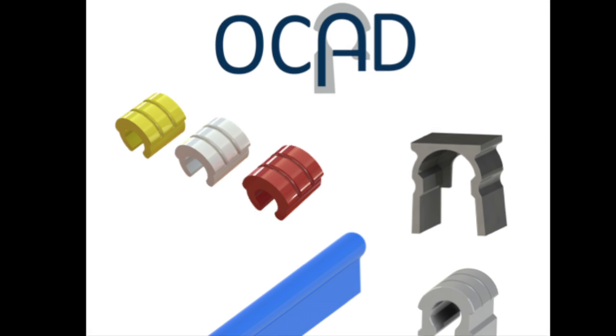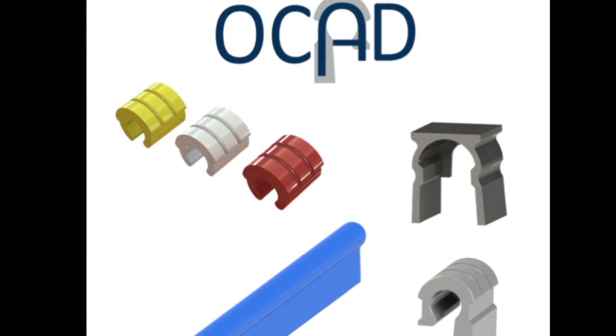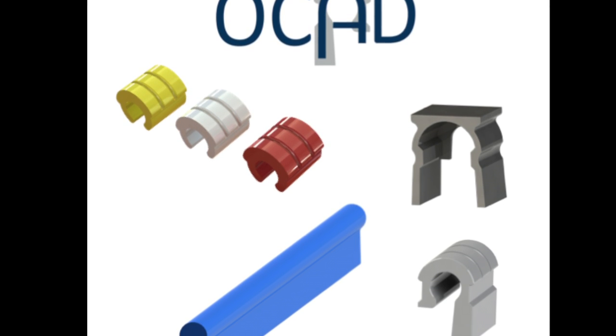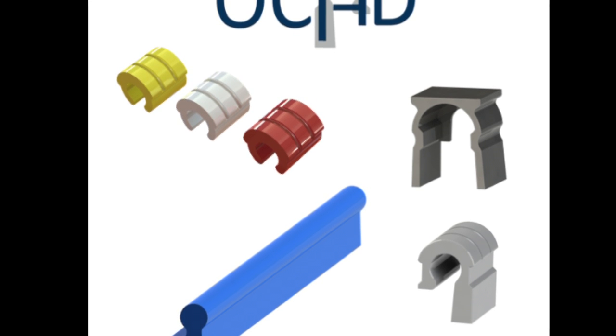The Hader bar has been the most popular bar attachment in dentistry for the past 40 years. However, it has some basic problems that all technicians, including me, have had to try to deal with. The new LV OCAD bar is an improvement on the Hader bar and can be cast or milled. It automatically creates indirect retention while still allowing a hinging function.